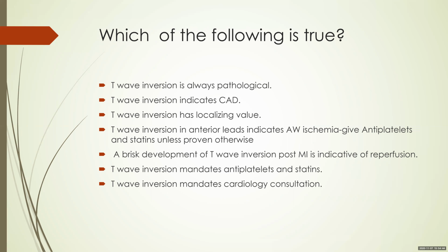A brisk development of T-wave inversion post-MI is indicative of reperfusion. That is true. If you have a brisk development of T-waves within 4 hours, you can probably suggest it is a reperfused myocardium. T-wave inversion mandates antiplatelets and statins. Again, that is false. All T-wave inversions do not do so. T-wave inversion mandates a cardiology consultation. Again, that depends. I leave it to the given doctor, because if you're not confident, you send for a cardiology consultation. If you're able to distinguish the cause, you need not do it.